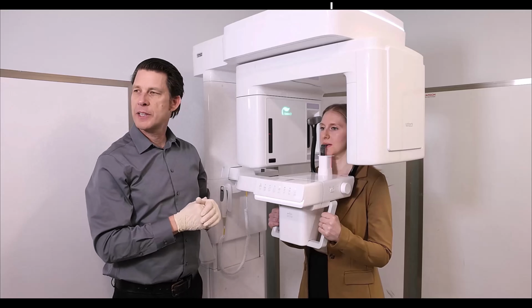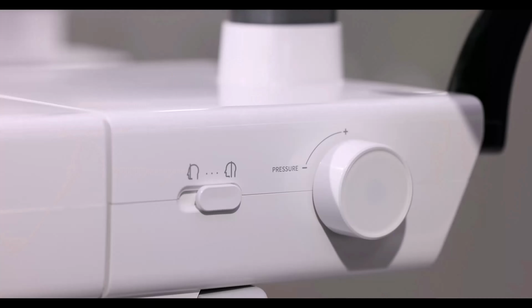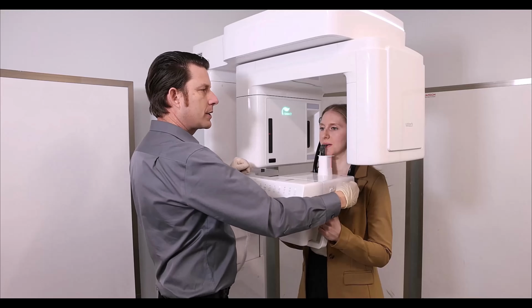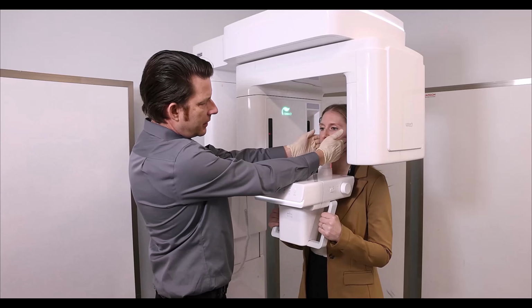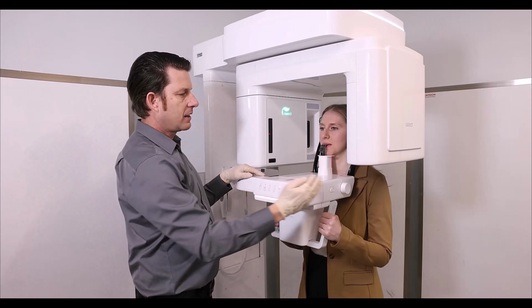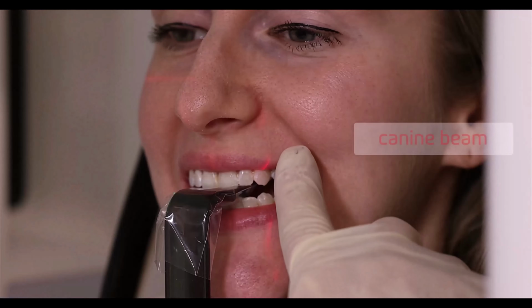My next step is going to be to close our temple supports. I use the wheel on the side here, and you'll see that they go ahead and touch the patient's head. I'm going to give them about a half turn more to make sure that they are snug so the patient does not move. I always go back through and double check the mid-sagittal beam just to make sure they're lined up center. And then lastly, have the patient smile really big. You can see here I'm moving the canine beam anterior posterior to get that lined up right through the center of the canine.